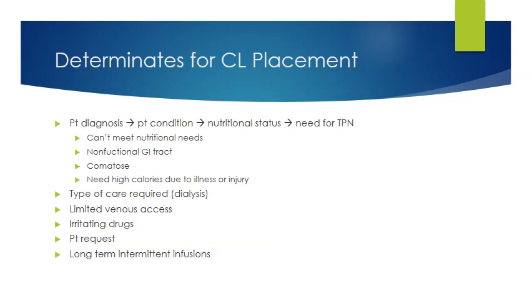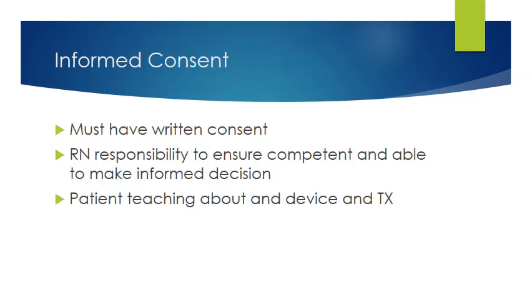So you're going to have to look at the type of care that's required. They may have limited venous access, irritating drugs that are going on. Patient may request it. Now, I'm not going to tell you that all times they're going to get that, because that's a more invasive procedure, but I have had patients come in and say, they can never get a line in me, and I've had to have a PICC the entire time. So I would discuss that with the physician before I ever stuck them, and then we would decide what was the best route to go. And then again, long-term intermittent infusions, and that would be like outpatient antibiotic therapy that we've already covered.